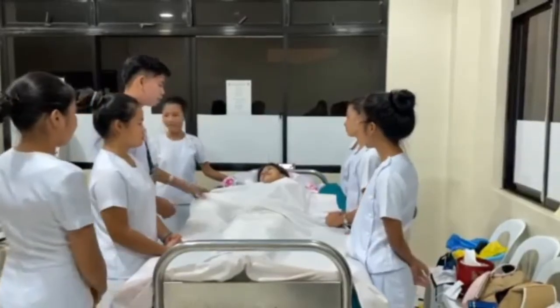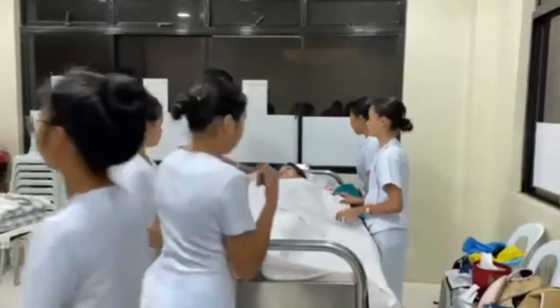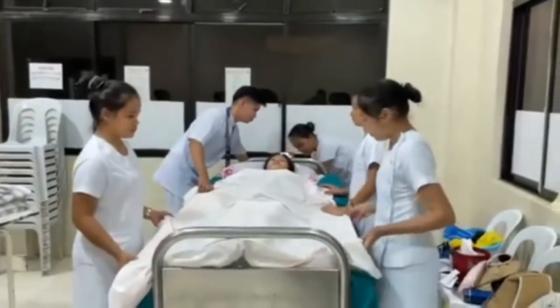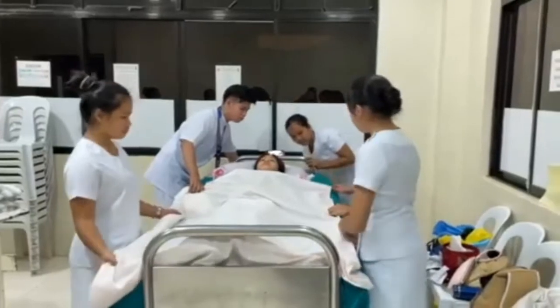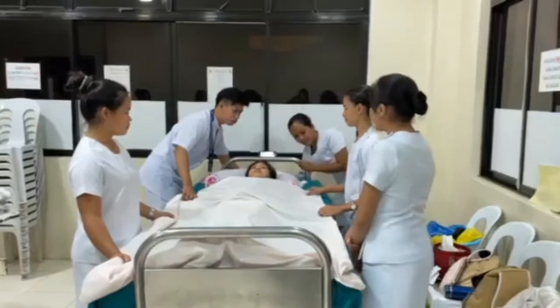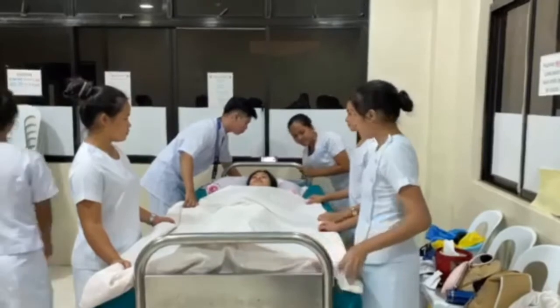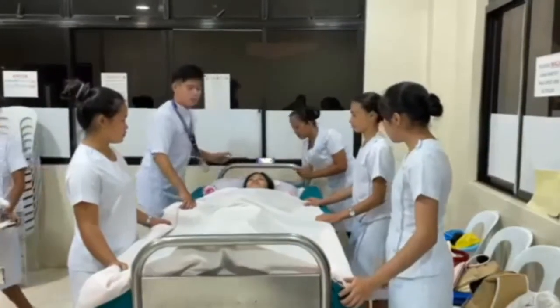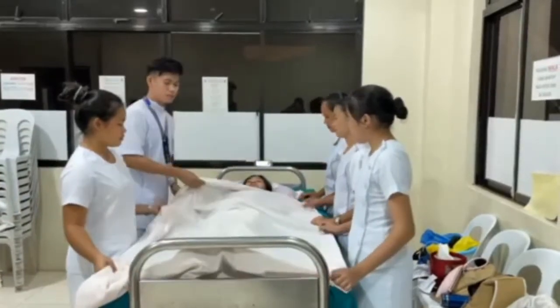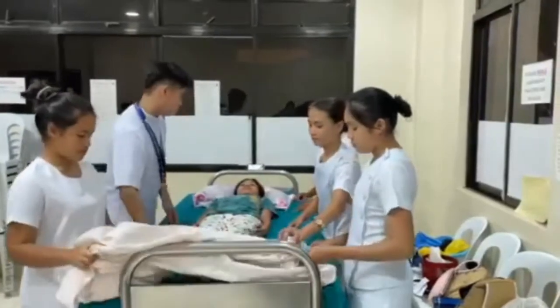Step 1. Adjust the client's bed in preparation for the transfer. Lower the head of the bed until it is flat or as low as the client can tolerate. Place the friction-reducing device under the client. Raise the bed so that it is slightly higher, half an inch, than the surface of the stretcher. Ensure the wheels on the bed are locked. Place the stretcher parallel to the bed next to the client and lock the stretcher wheels. Fill the gap that exists between the bed and the stretcher loosely with bath blankets.